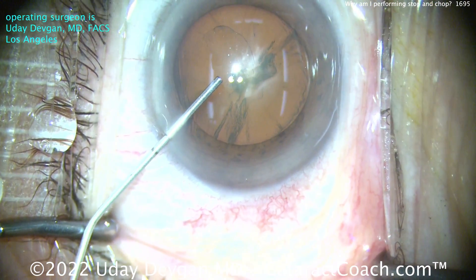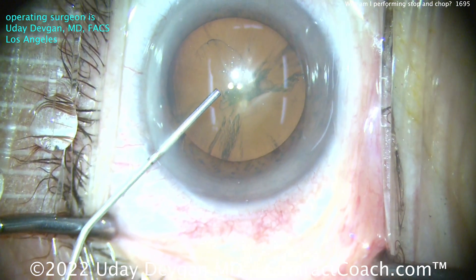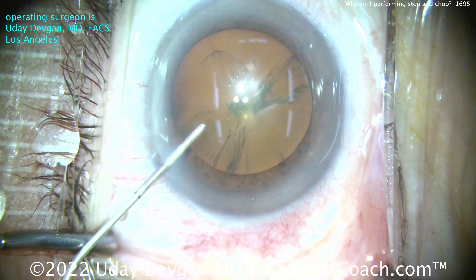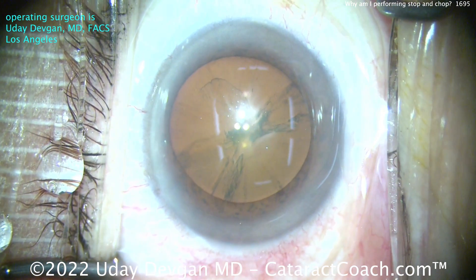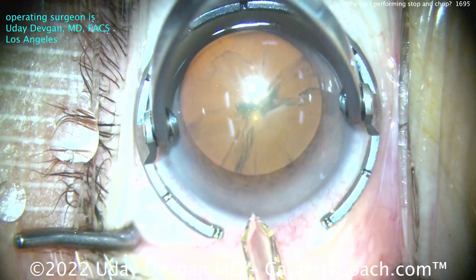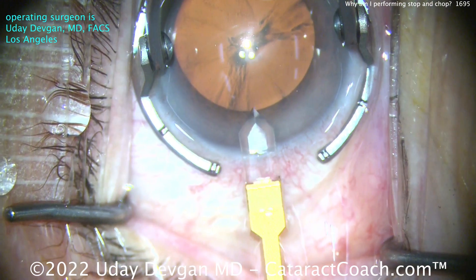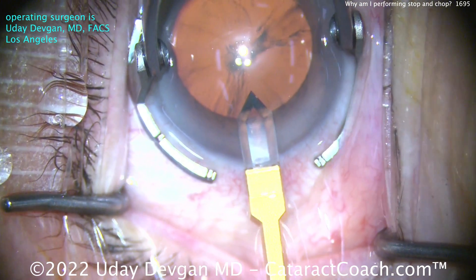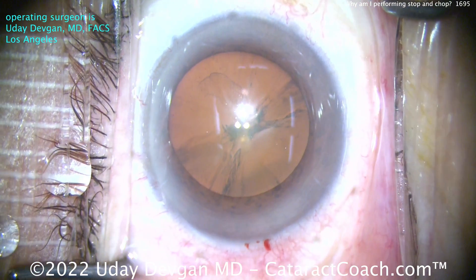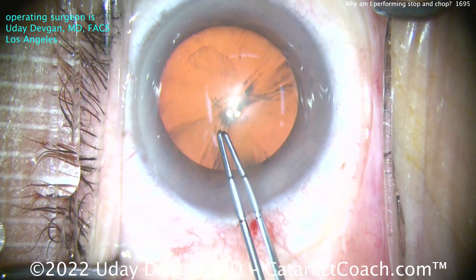Here's an eye. Look how shallow the anterior chamber is. I know it's hard to appreciate in 2D, but this is a patient with a very shallow anterior chamber — a little bit less than two millimeters deep. The patient is also very hyperopic, going to get a 29-diopter lens. Using a diamond keratome here to make a nice small incision, about 2.2 millimeters. That diamond keratome is about 1.8 — a very tiny keratome. Now watch as I do the rhexis; you'll really appreciate how shallow the anterior chamber is.